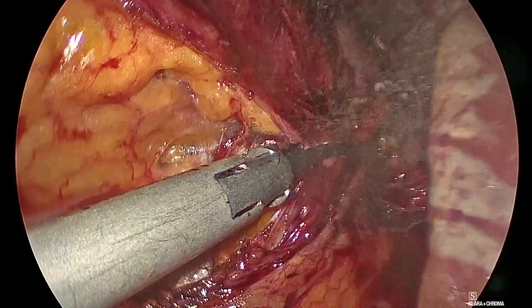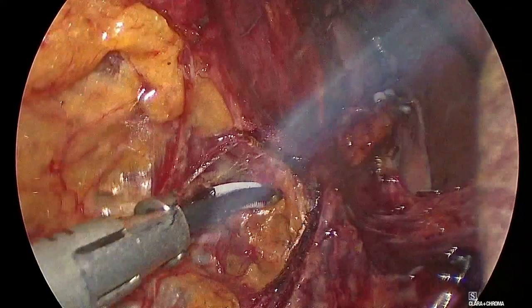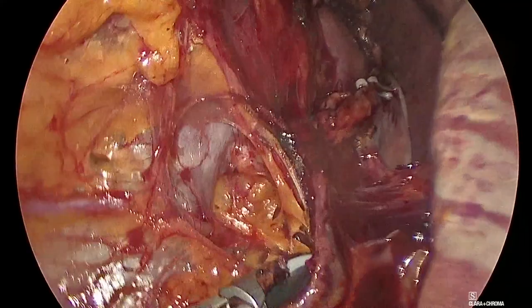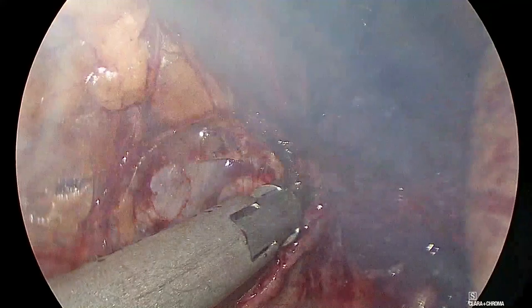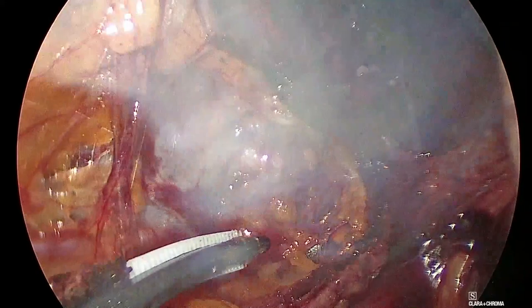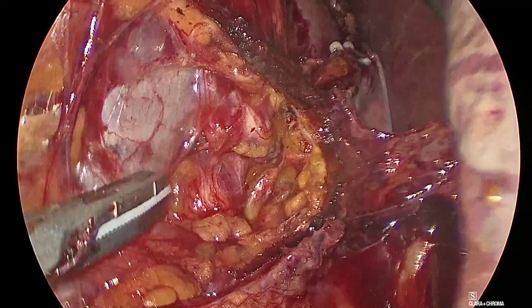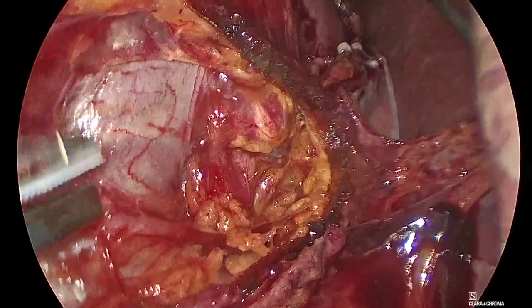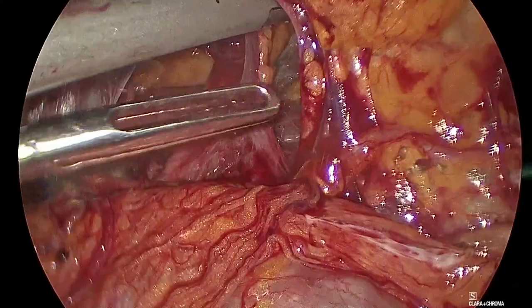Okay. So it's just a matter of going little by little now, expose the hilum, and then we will take that artery and vein that we saw, and I think that the main artery is right in here, okay? So it's a little bit anterior to the hilum. Okay, so the tip of the adrenal gland is there, and you see that there is the artery here. So this is one branch of the artery, no doubt. And that's the main, okay? So the main artery is there. Okay, let's see. Move back here, vente aquí. Okay, vamos aquí. Retírate un poco.